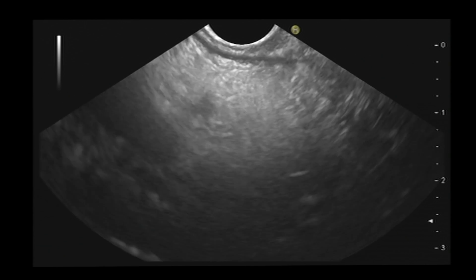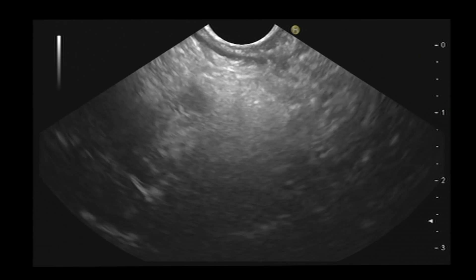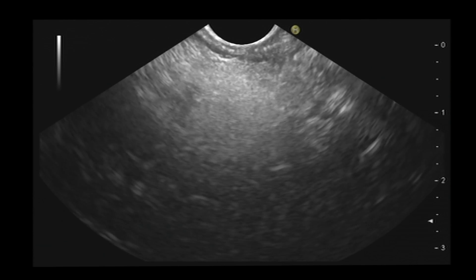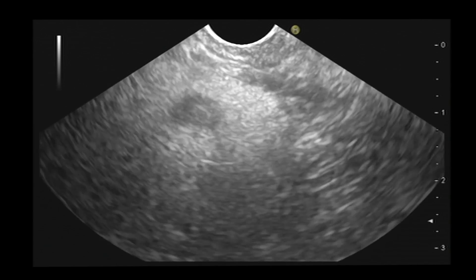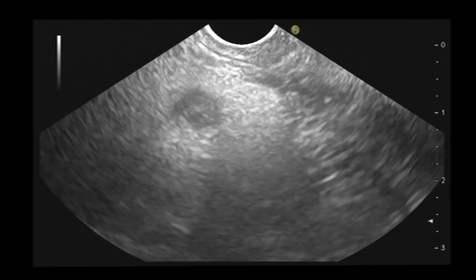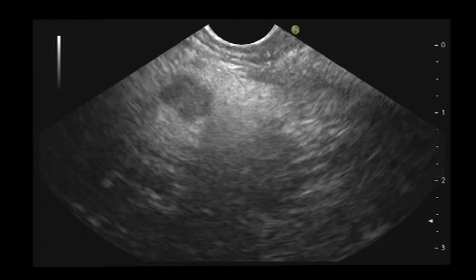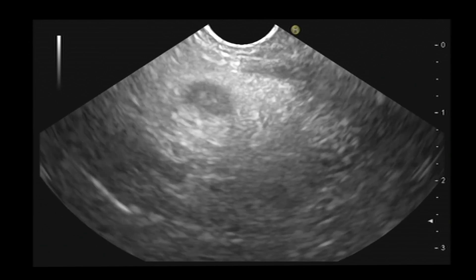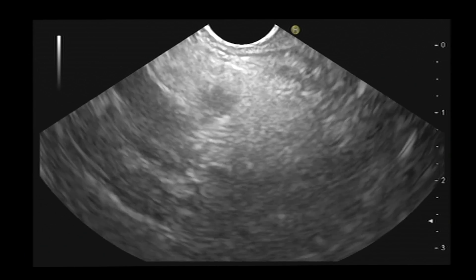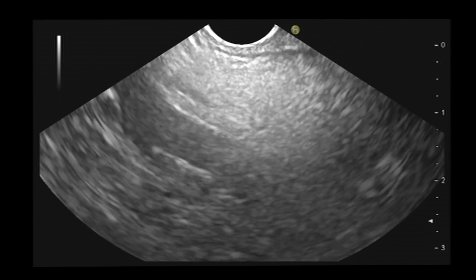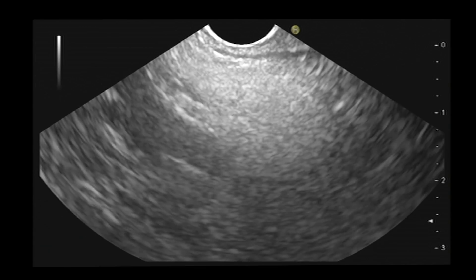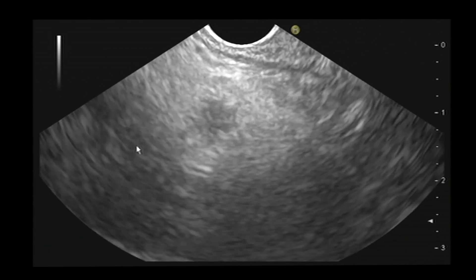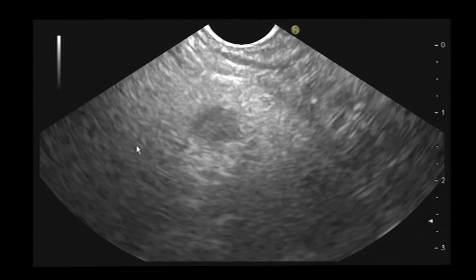Here we have the portal vein. Let me try to give you a better image — yes, this is better. Here you have the portal vein. You see that there is no contact with the portal vein.